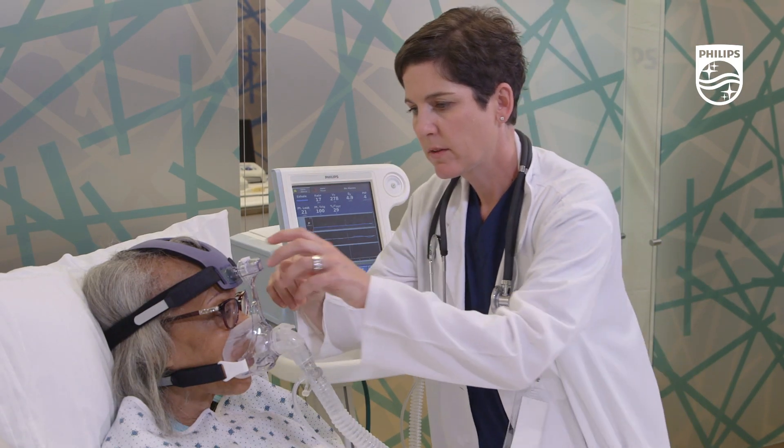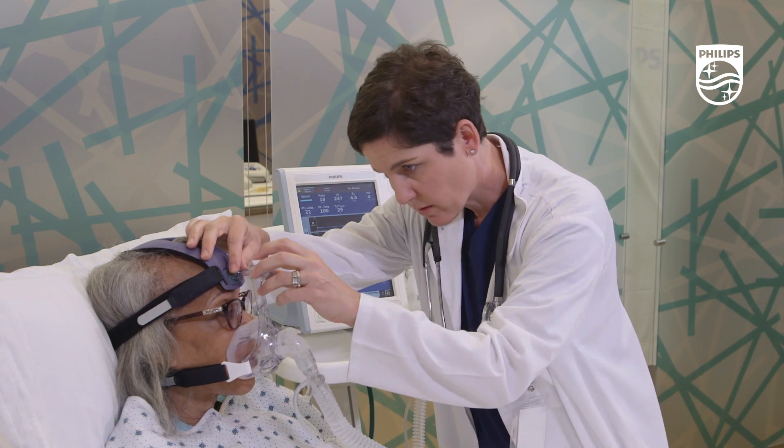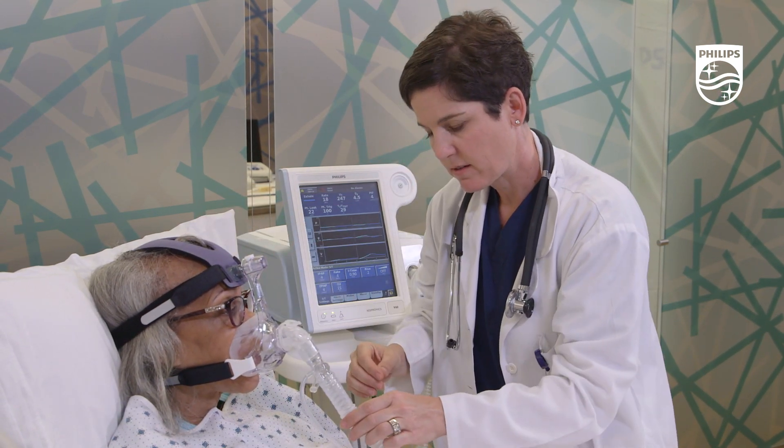Leaks around the nose and eyes should be addressed using the frame slider, which adjusts inward to tighten or outward to loosen.